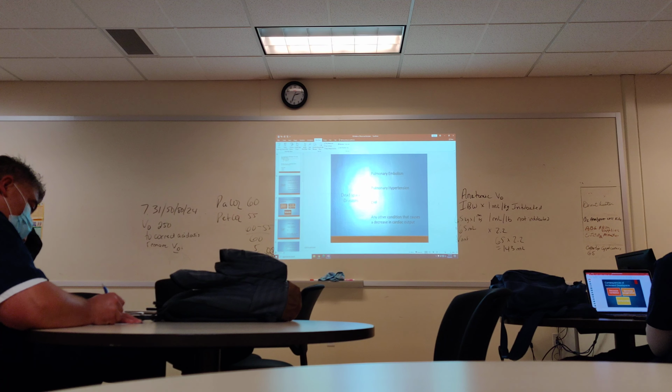Why do I care? Dead space is very important when you're looking at something called alveolar ventilation. You guys know what minute ventilation is. What's minute ventilation? Respiratory rate times tidal volume. It's the amount of gas volume exchanged in a minute. Minute volume. Every minute I exchange roughly between 5 to 8 liters of gas volume just sitting there quietly. Not when you're exercising, not when I'm lecturing, but if you're sitting there watching TV, that's what you're doing.